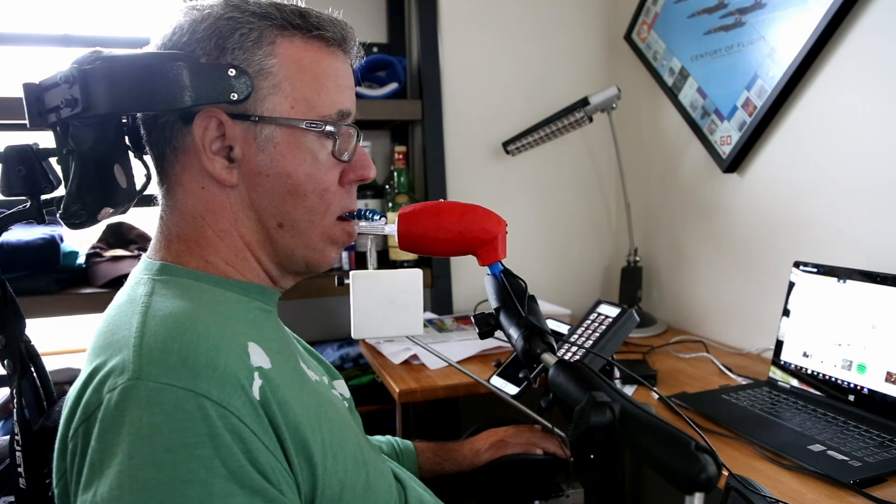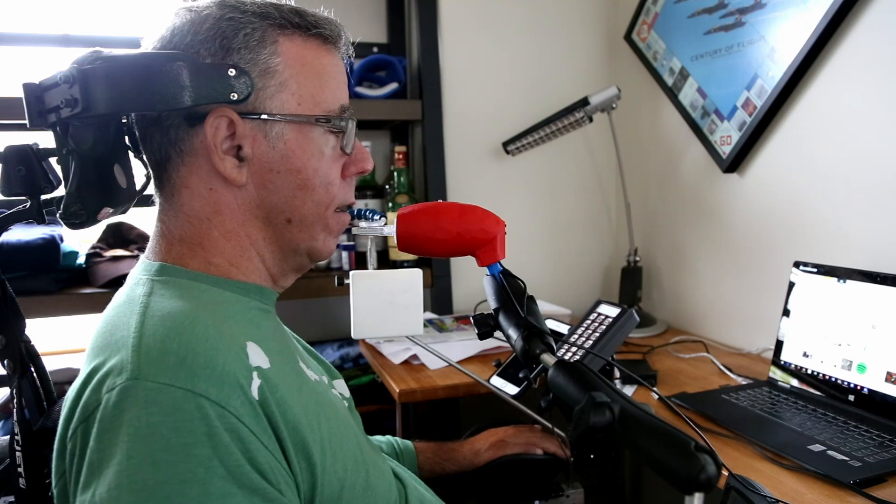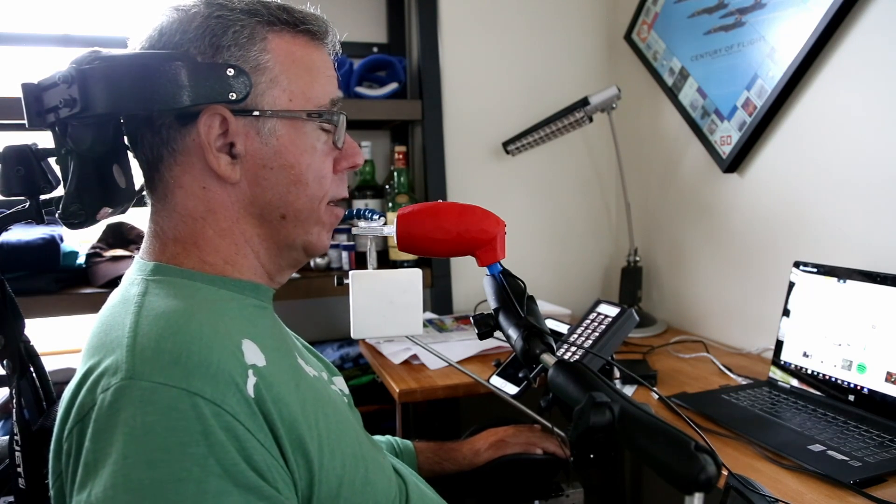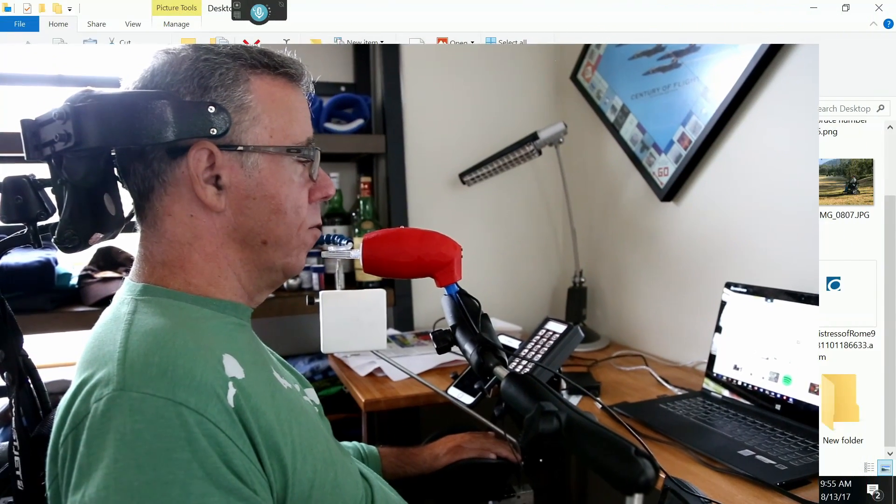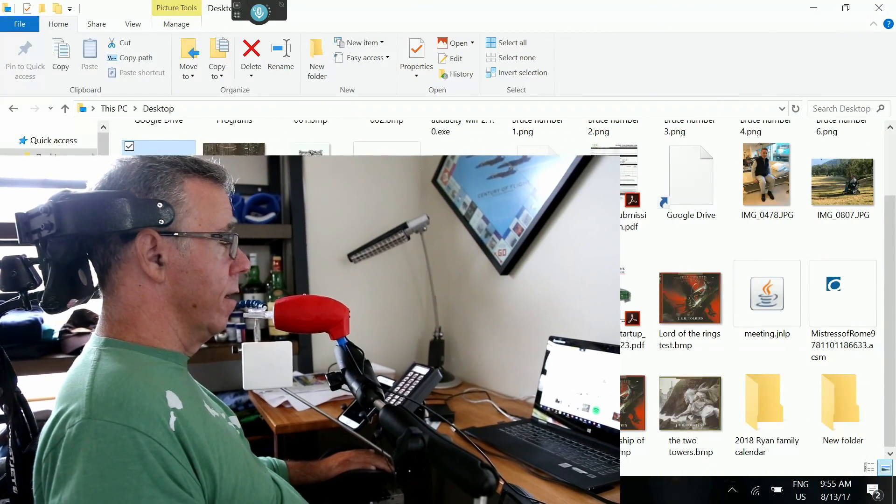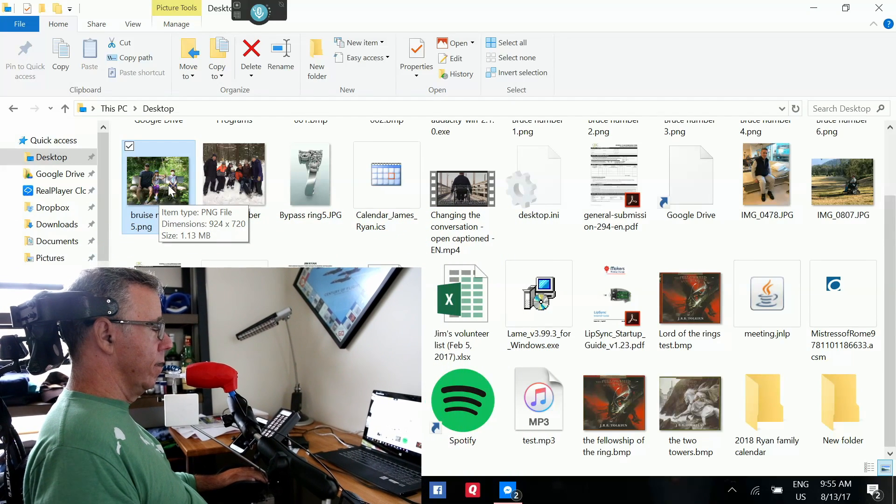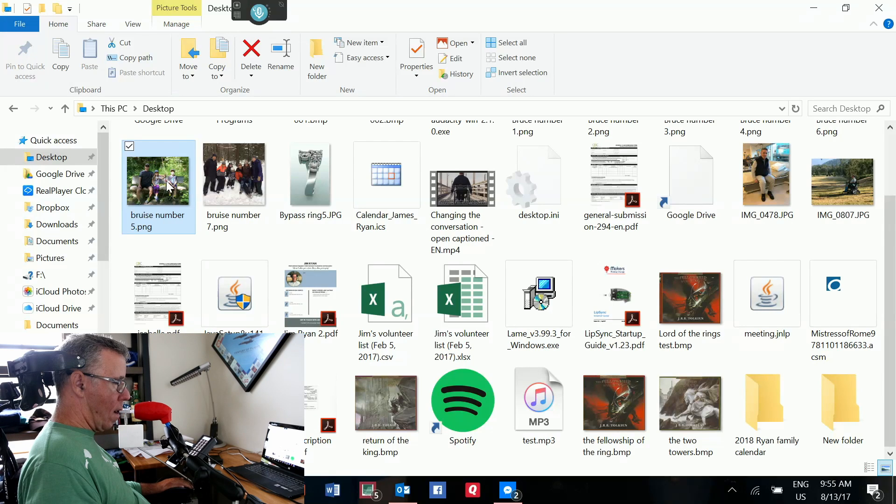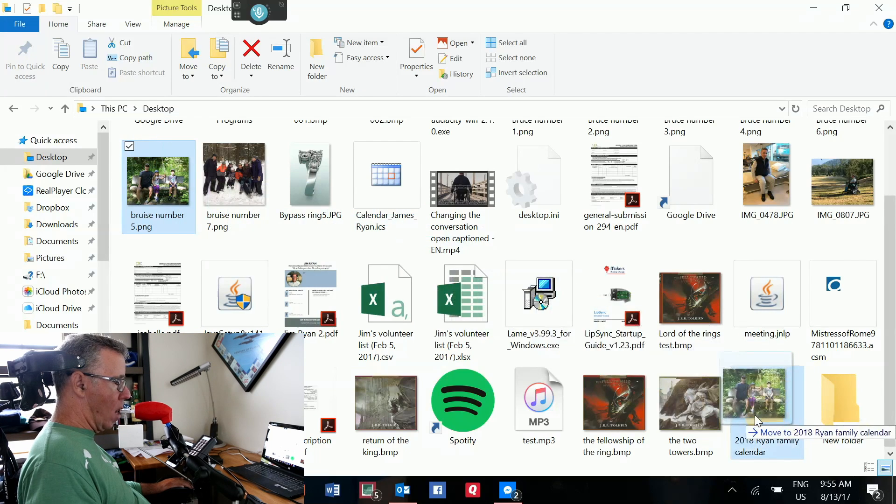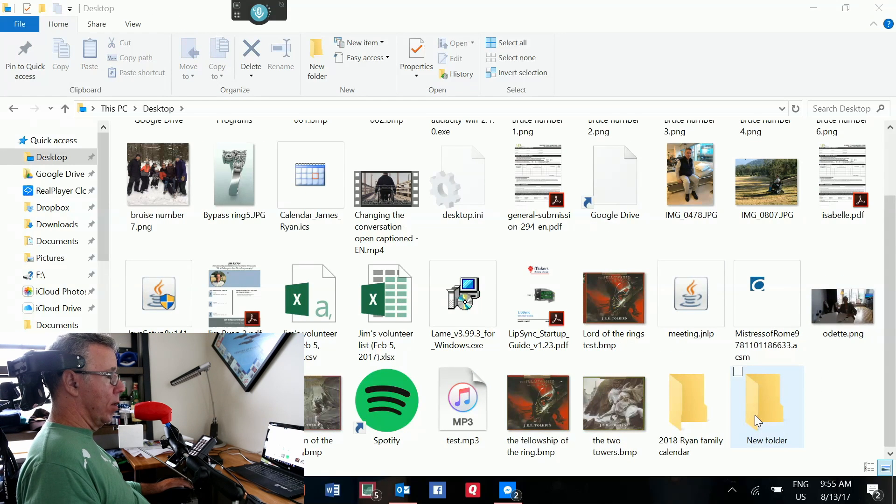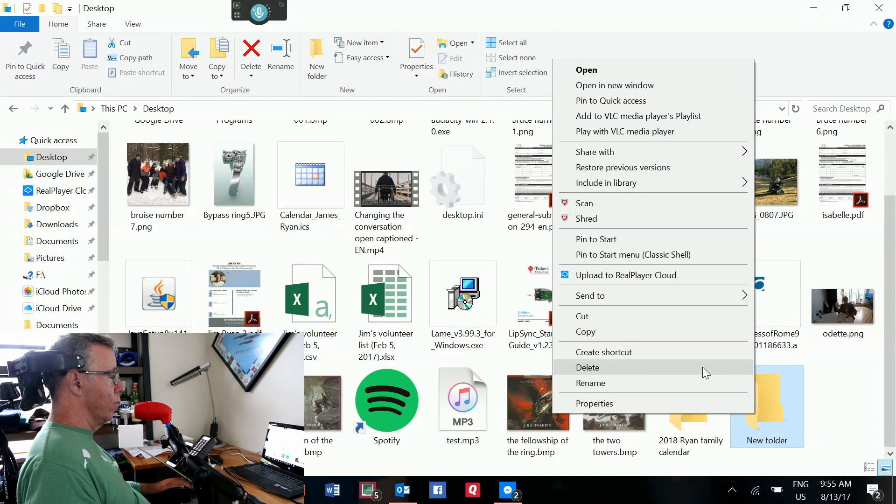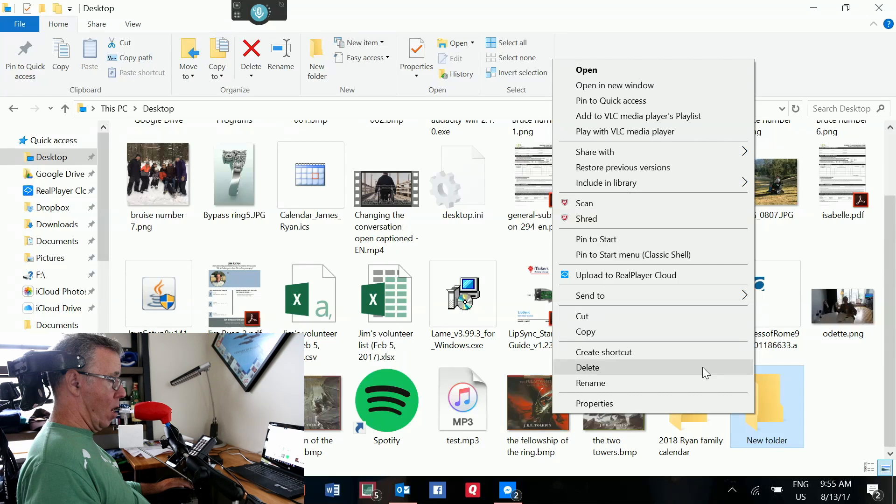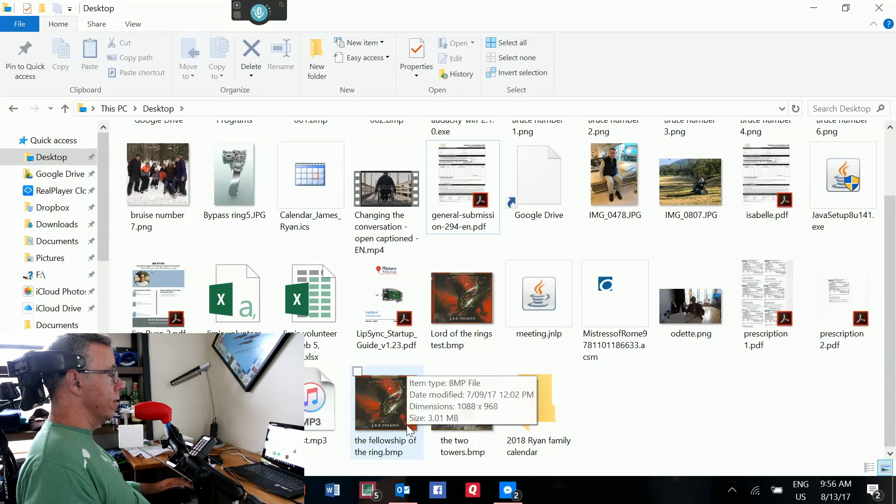Okay. So, we talked about clicking and dragging, but we made that folder. So, I know clicking and dragging is really, really hard. So, can you give me a demonstration of what you can do next? Well, I'm going to try here. Let's see if I can do this. So, I think if I hold for three, if I puff for three seconds, that locks it in. And I should be able to drag it over. Let's see if I get any luck here. There we go. That was easy. There we got it. It doesn't always work that well. But when it counts, it matters. Yeah, I'm just going to delete this folder here. So, to right click, I sipped. And then I move the mouse to delete. And it's gone. It's a bit slower than what you guys do. But I'm actually a lot better than it used to be.